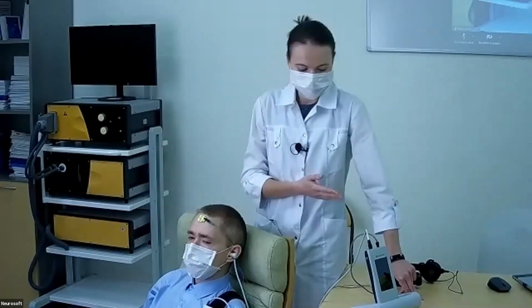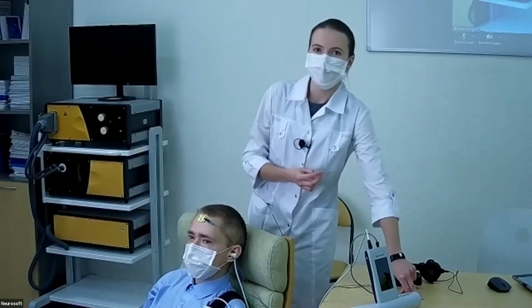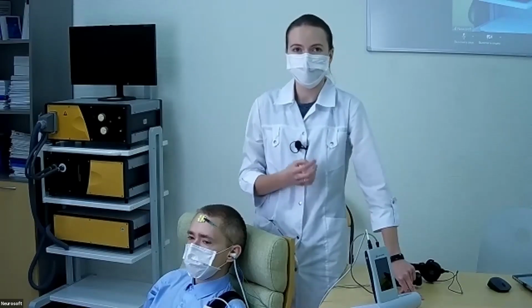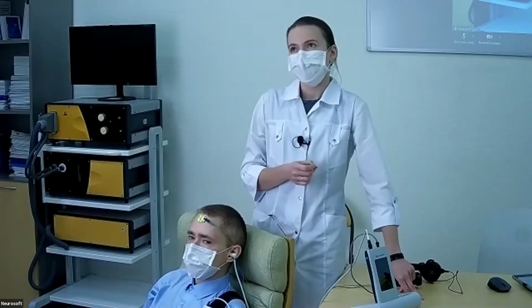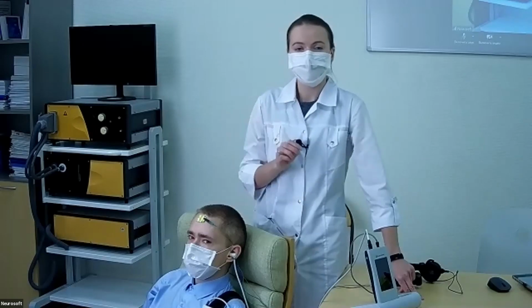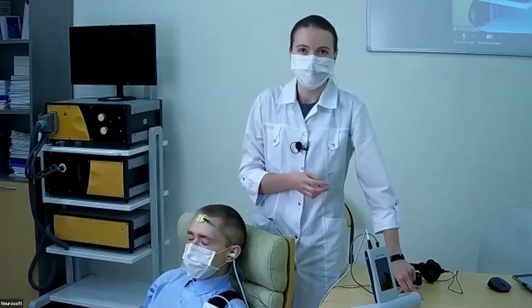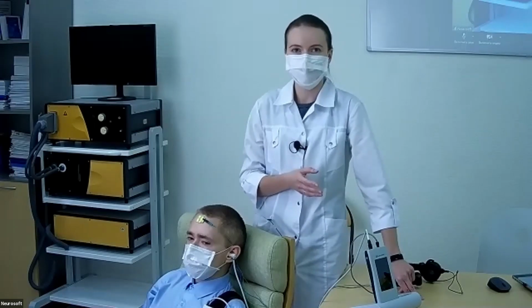So this test is a screening one, so it can be performed by a nurse or with the help of a technician, and it doesn't require visual inspection of the curves, which we did yesterday in the ABR, where we put some peaks and so on. This test doesn't require such attention because it's totally automatic, and you get the result pass or refer.